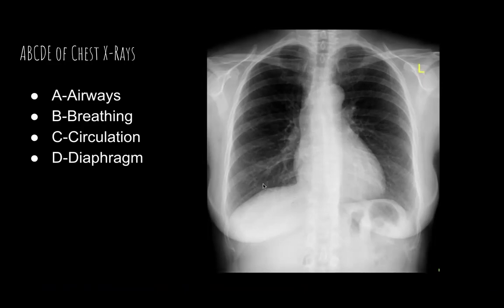You don't want it to be a straight line, a straight border right over here. You want to see that angle go down all the way, which you do see on both sides. But you don't want the angle to be too steep down here either. You want to be careful, because this angle is too steep. That also signifies some disease processes.